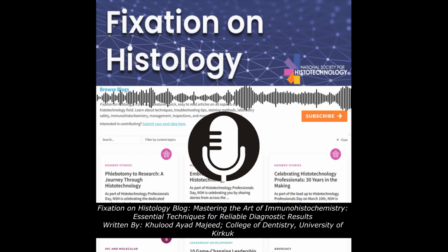Blocking endogenous activity. A common issue in IHC is background staining due to endogenous enzyme activity or nonspecific antibody binding. To avoid this, it's essential to block endogenous peroxidase and biotin activity before applying antibodies. Failure to block these endogenous molecules can lead to false positive results. Peroxidase activity, for example, is commonly present in red blood cells and can produce unwanted staining.